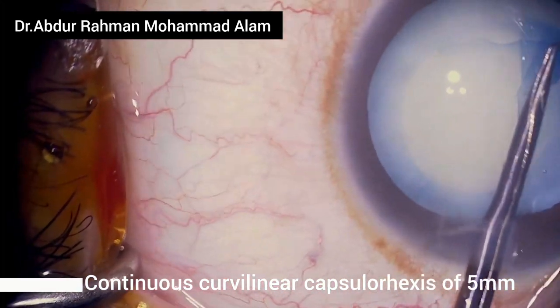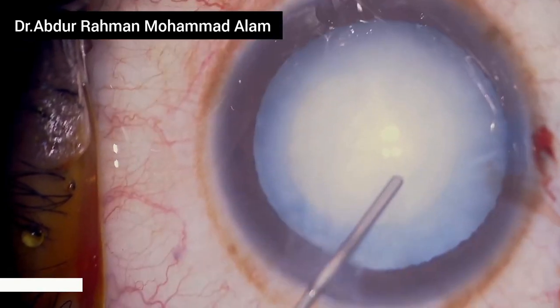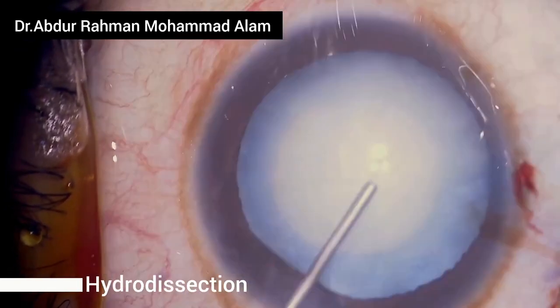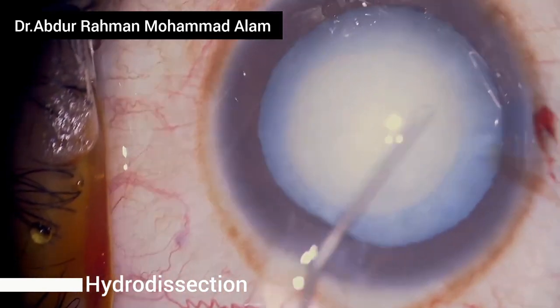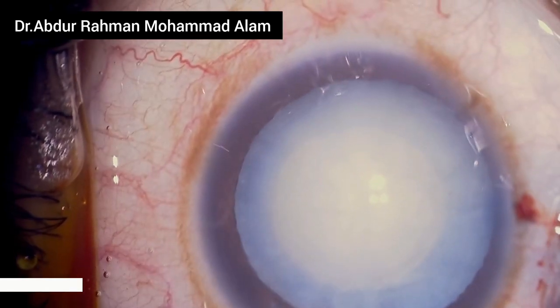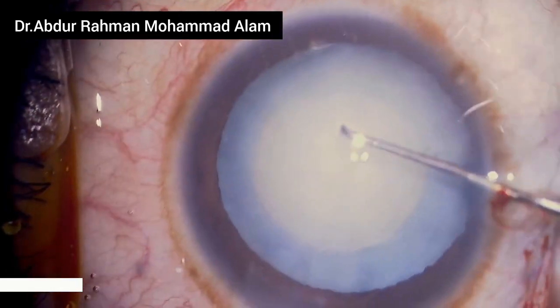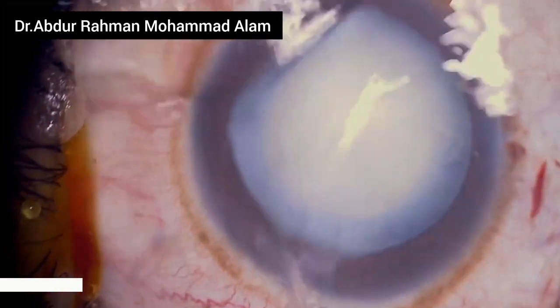I was able to create a continuous curvilinear capsulorrhexis of 5 millimeters. I take out some OVD from the anterior chamber and perform hydrodissection. Now I fill the anterior chamber with OVD and rotate the nucleus to confirm successful hydrodissection.